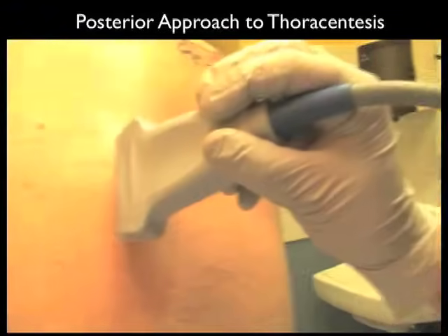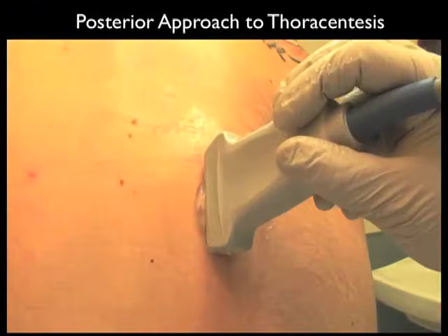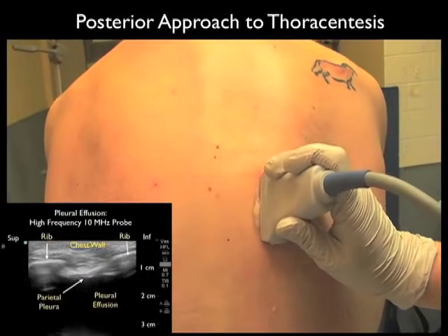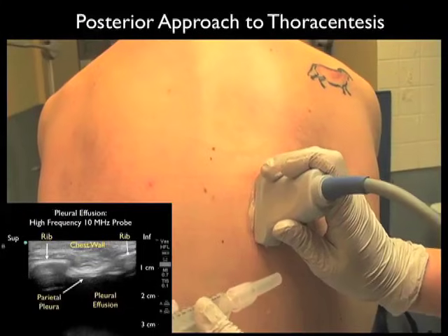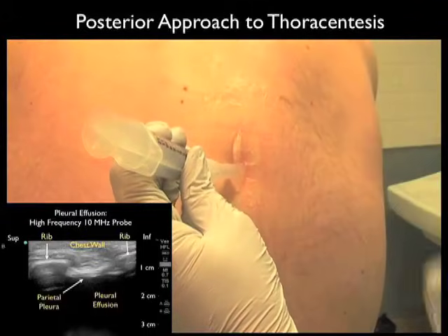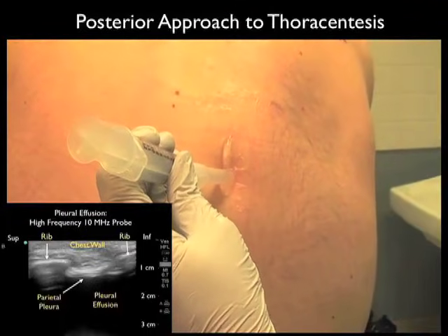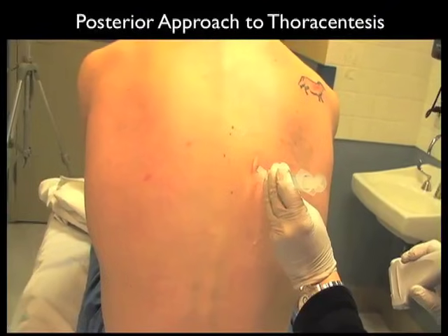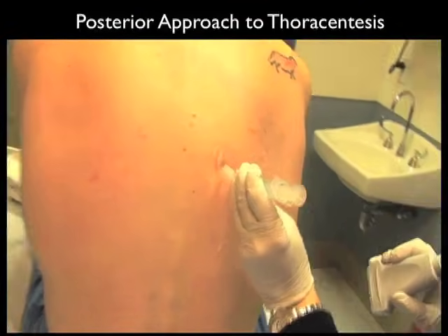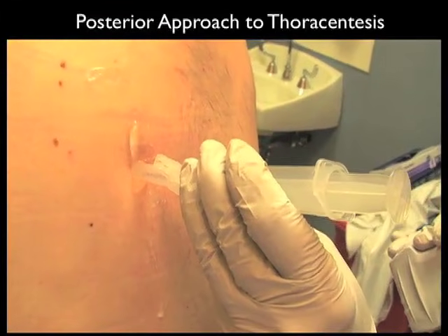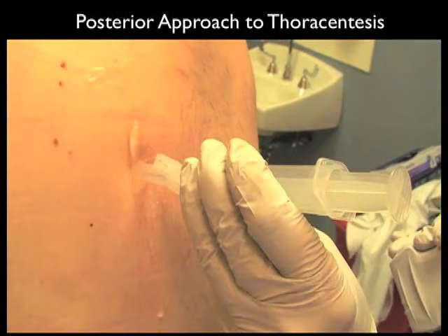In this video clip we'll first place the high frequency 10 megahertz probe along the posterior aspect of the chest wall to define the proper orientation for the puncture for the posterior approach to the thoracentesis procedure. The needle can then come in directly underneath the probe as shown here. Now I'll show a wide angle shot — note this is the proper position for the thoracentesis needle as defined by sonography from the posterior approach to thoracentesis.